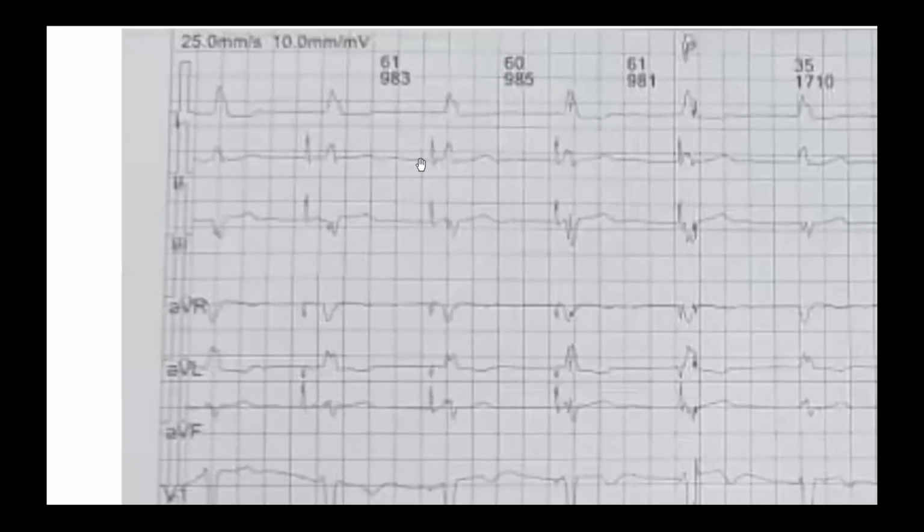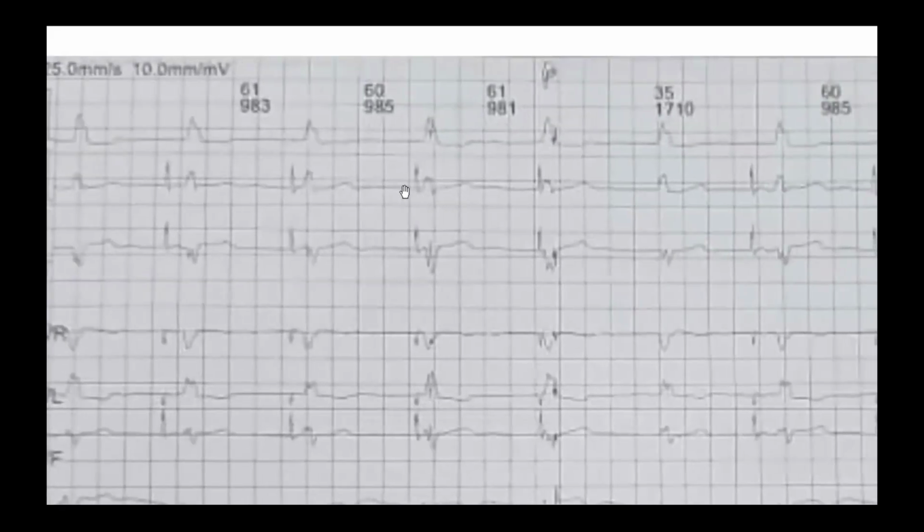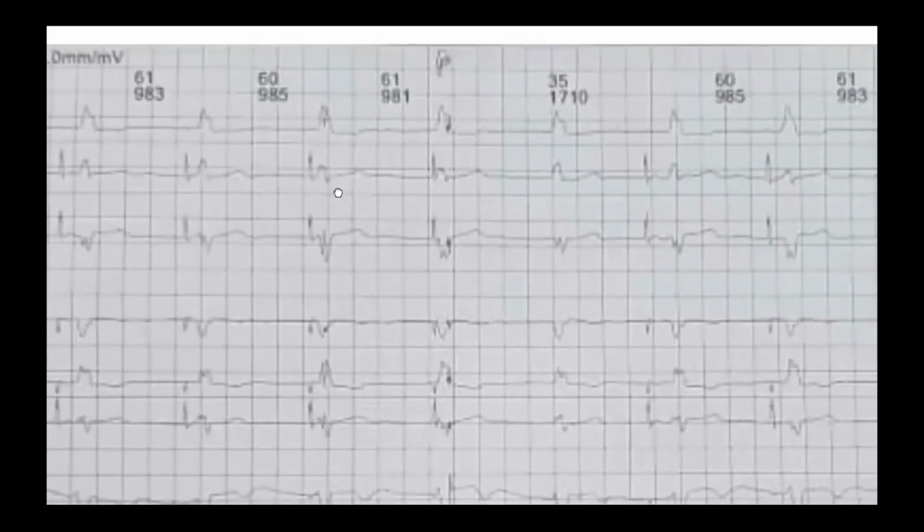So that was the case. He tested the atrial lead alone. He tested the ventricular lead alone. He tested sensitivity. Everything was perfect. So how do we solve this problem? We made the lower rate 70 to overcome the junctional escape rhythm to preserve the AV synchrony of the patient. Do you have the ECG after correction?